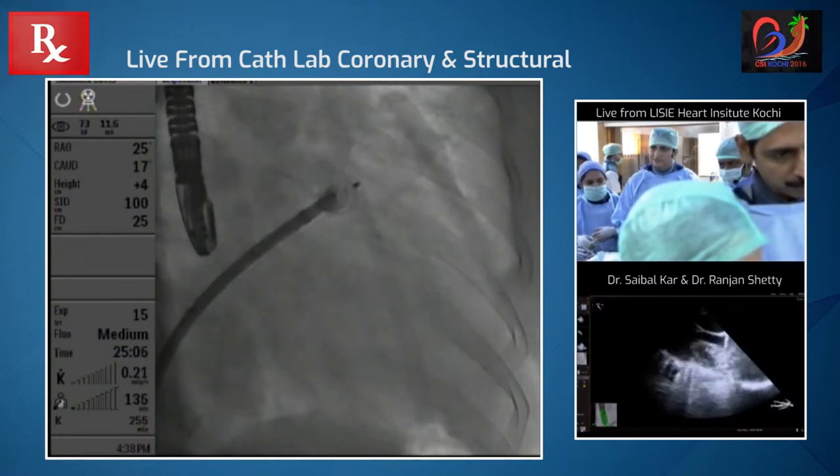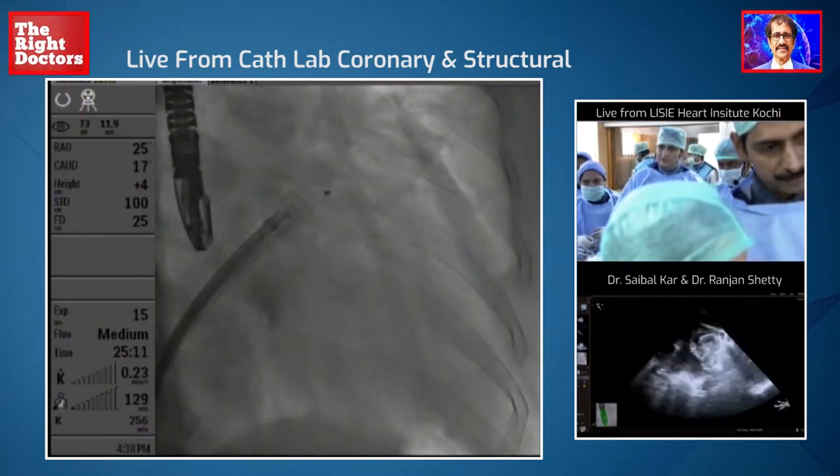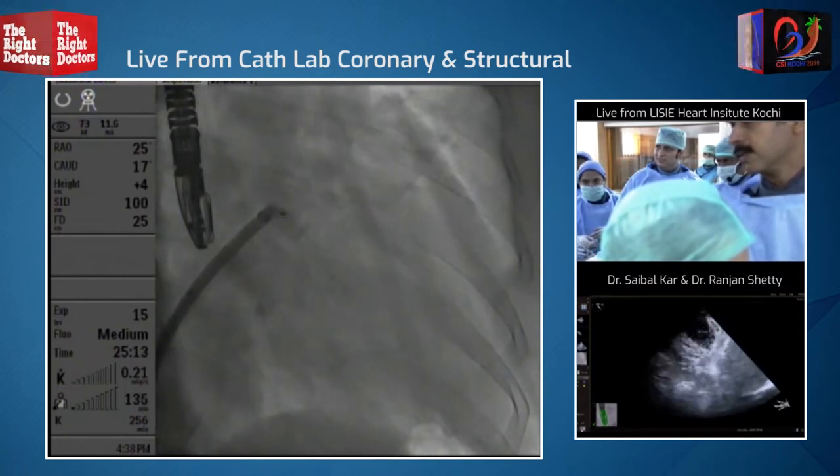A little contrast, and so this looks quite good. We are still quite deep inside, but I'm going to push the device out. And it popped out — so that's the problem.